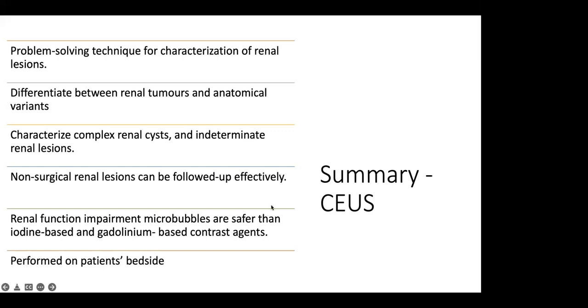Yeah, I think those AMLs which are lipid-poor or with poor fat are sometimes a diagnostic challenge for the radiologist as well, because differentiating them from renal tumor is difficult. And there can be RCCs which may have fat, but usually it is said that for CT, if there is absence of calcification or ossification, then the diagnosis is more in favor of AML.